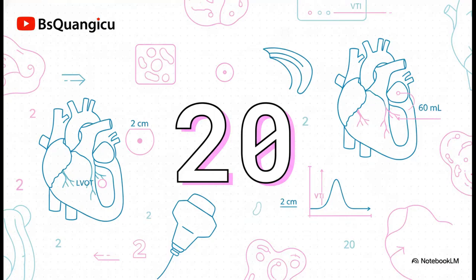Next up, the guide shares an absolute game changer of a POCUS cheat code, the number 20. Think about it. If you run that cylinder formula in reverse, using a 2-centimeter diameter and a normal 60 milliliter stroke volume, a normal LVOT VTI comes out perfectly to about 20 centimeters. Memorizing those two numbers gives you an instant, built-in reality check when you're at the bedside scanning.